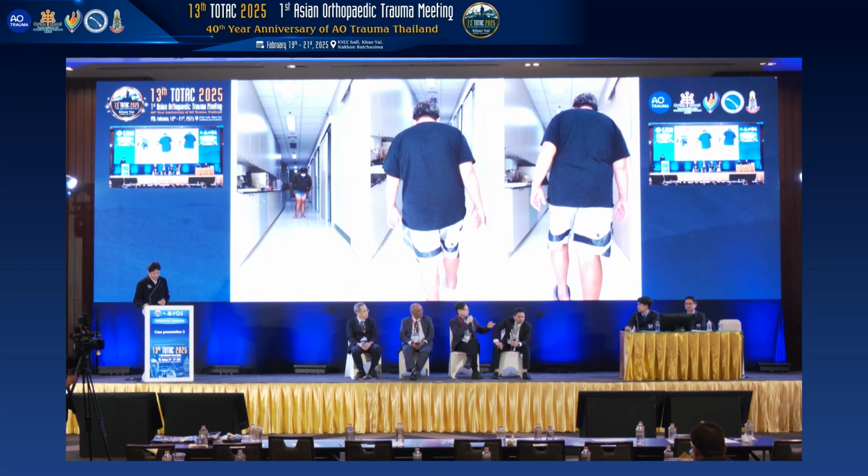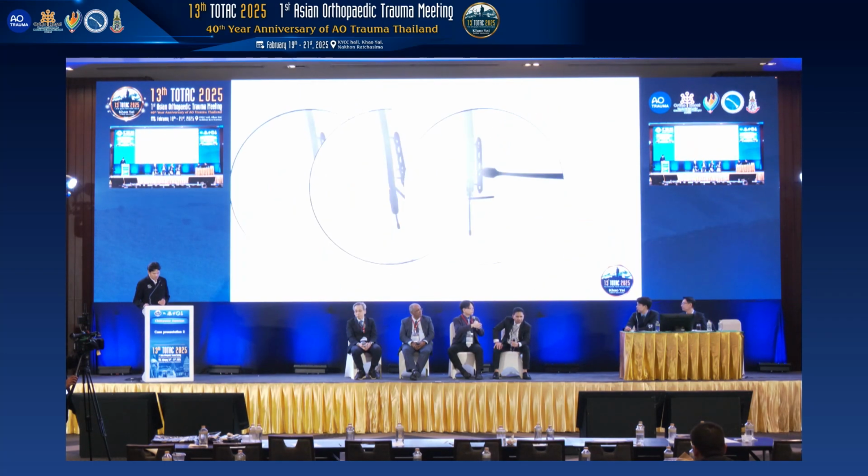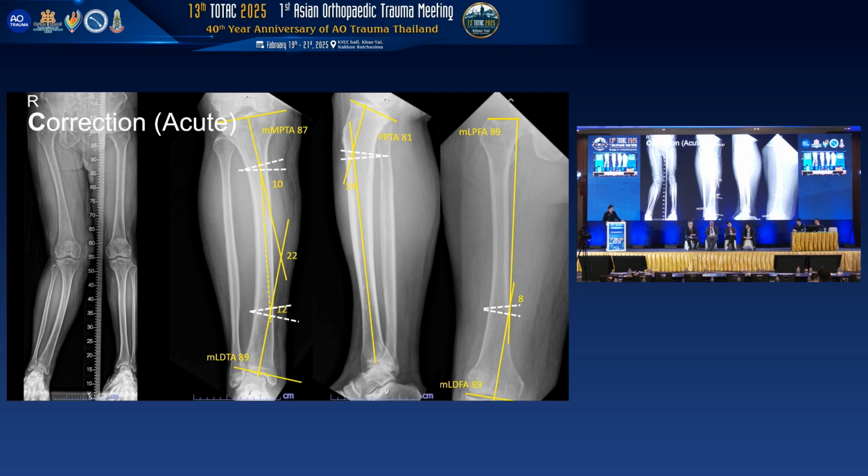Yes, actually, I just talked to Vajra regarding the selection of nail or plates for the femur. I think we have the same situation. Because the lesion is higher, nailing is good, better. But if it's close to the metaphyseal junction, metaphyseal areas, I would go plate. Yeah, I agree with that because the CORA is a bit high.